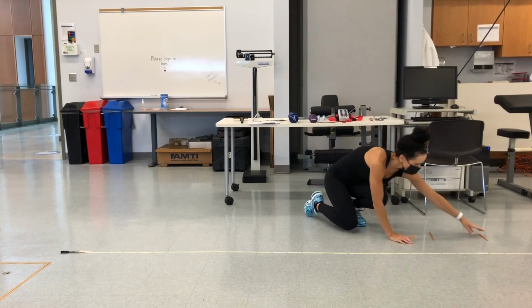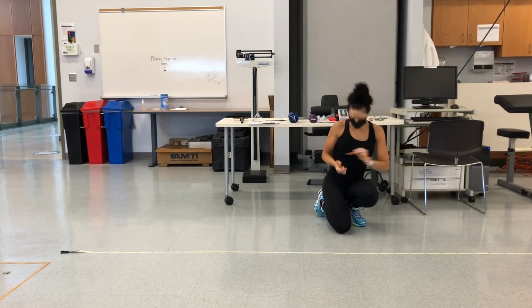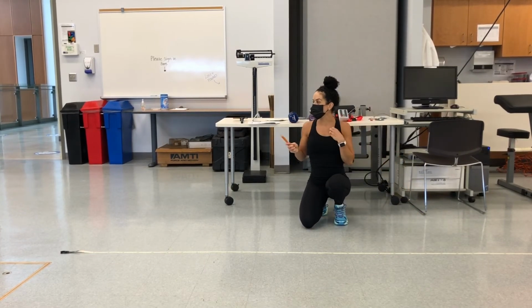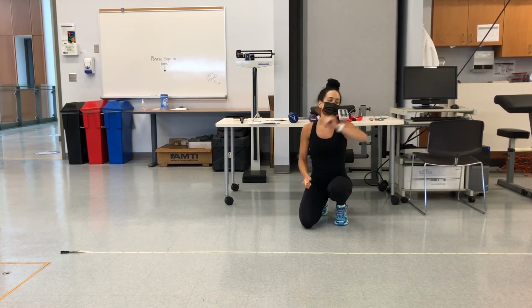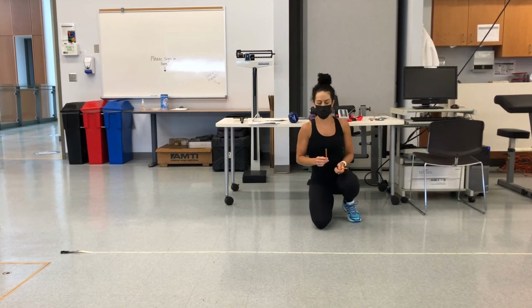Okay, so this time we are going to do stride time. Just press your stopwatch when you're close to me, when a foot hits, whether it be left or right, and then the next subsequent time that same heel hits. And we'll go from there.